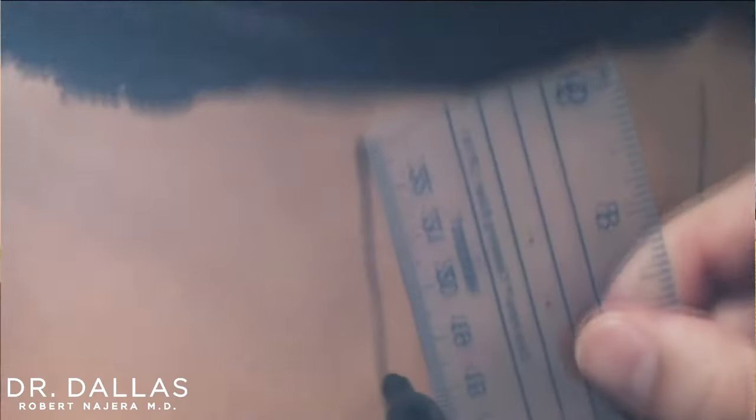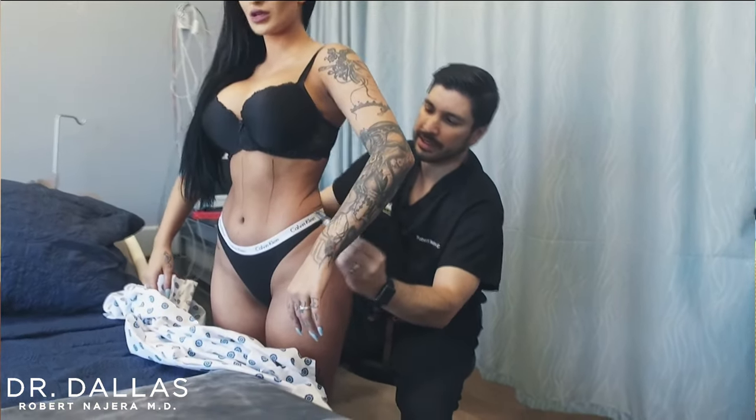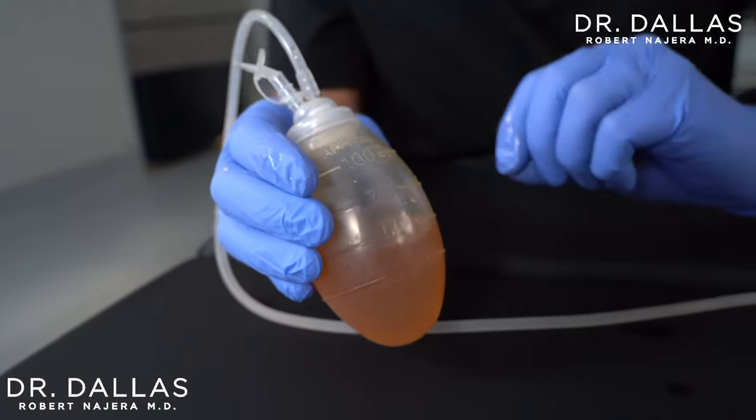On this segment I want to talk about stripping a drain — what does that mean and when do we do it? We use a drain in the first place typically underneath tummy tucks, to take some of the fluid that accumulates underneath the skin. Over the first few days you'll typically see Kool-Aid-looking fluid that drains into the end of the drain or the bowl.